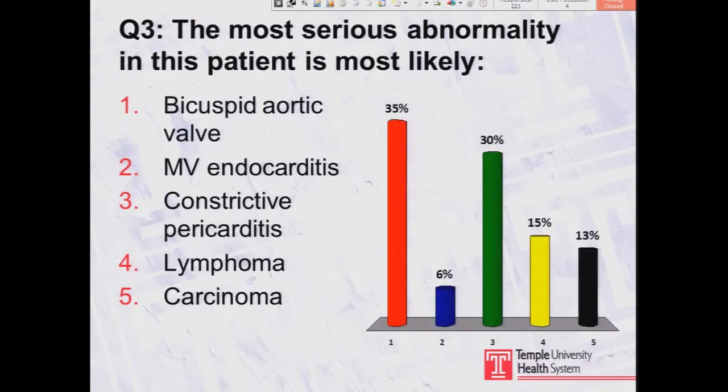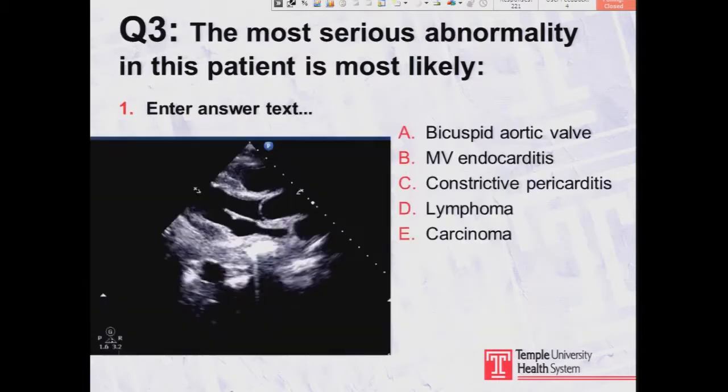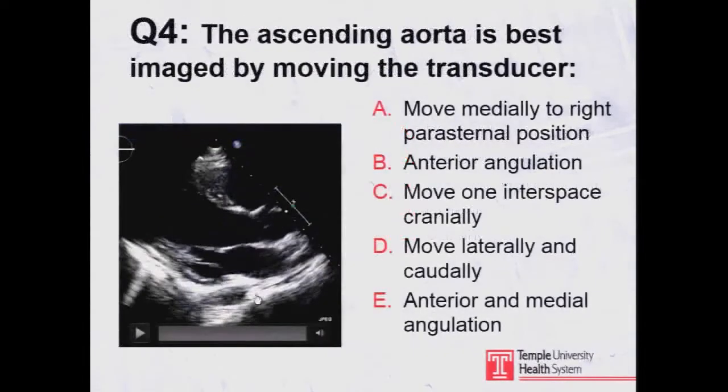Okay, so 13% of you were correct. You've got to read the question carefully, which is the most serious abnormality in this patient. It's not advancing. No?